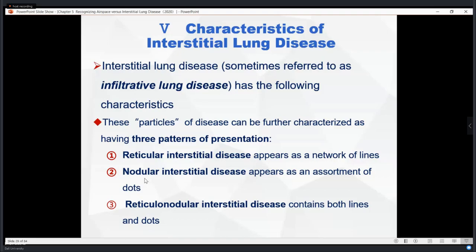You also have to remember, if you can remember it from the last chapter, what we were talking about is that any kind of patchy opacity shows up as airspace disease, right? Most lobular pneumonias and segmental pneumonias all appear as patchy opacities.